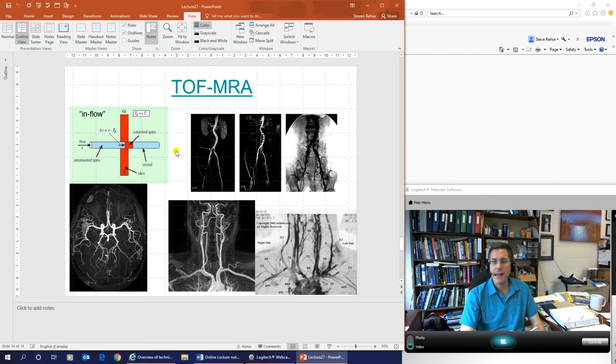Usually it's bad, but in this case, it's good, because what we're going to do is take the whole slice, bang them over, they start to recover, and then we're going to bang again. What happens? Nothing, because they're saturated. The area will be black. Aha, except for what? There's going to be an area in the blood vessel where those saturated spins have flown out. The fresh blood coming in has no idea that there's an MR experiment going on. So when you apply that second pi/2 pulse, the only thing that responds is that fresh blood that's moved in. And it responds great.